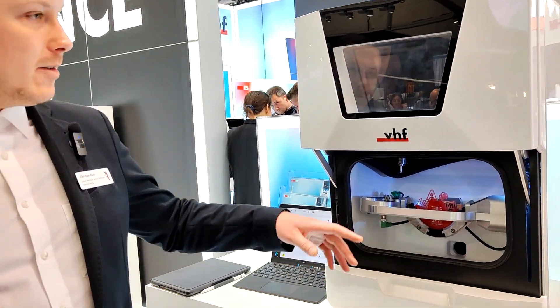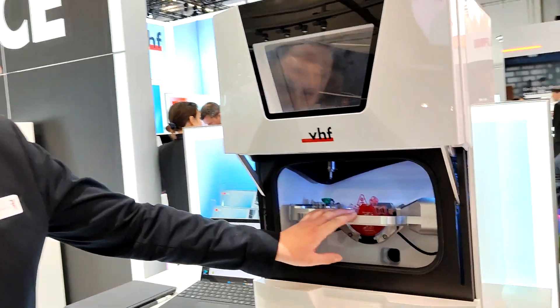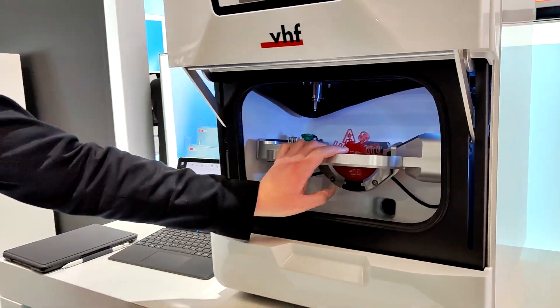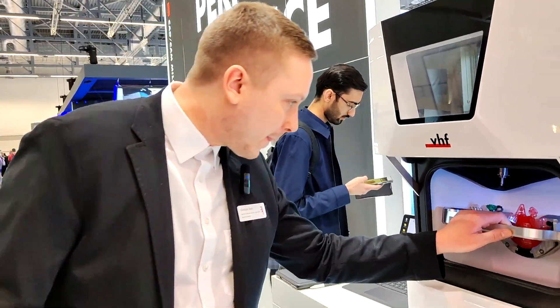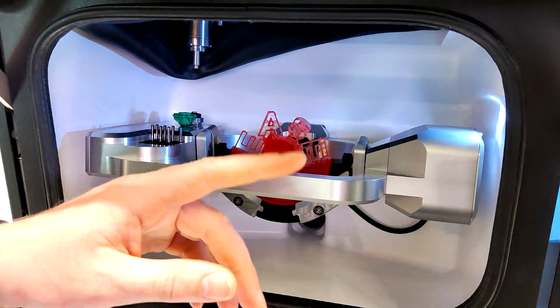The E5 is a 5-axis dry milling machine. It dry mills zirconia, PMMA, wax, PEEK, and composites — everything you need on a daily basis in your lab. The entire E-Series, including the E5, requires no compressed air.